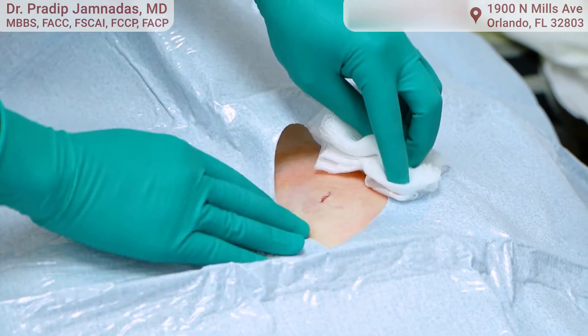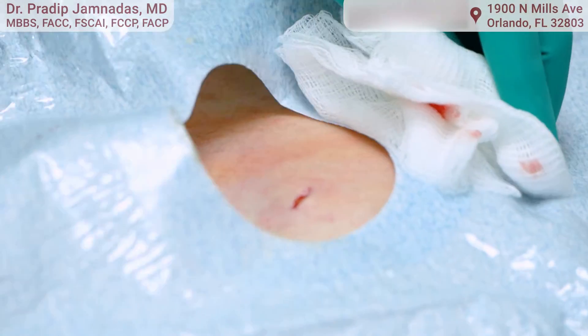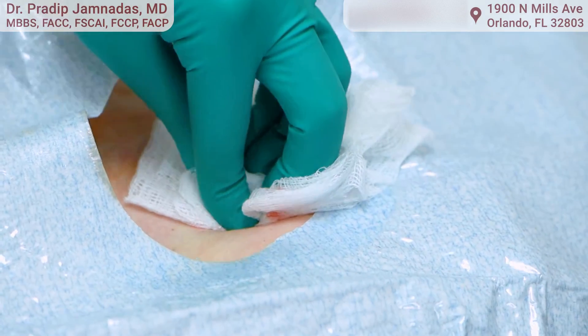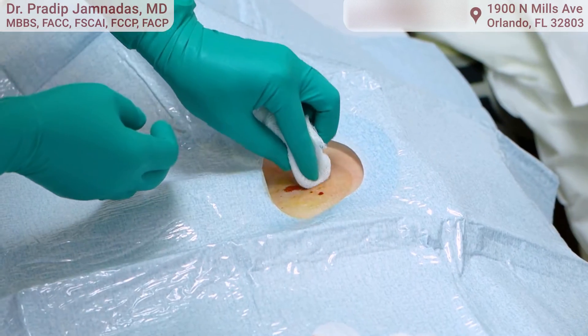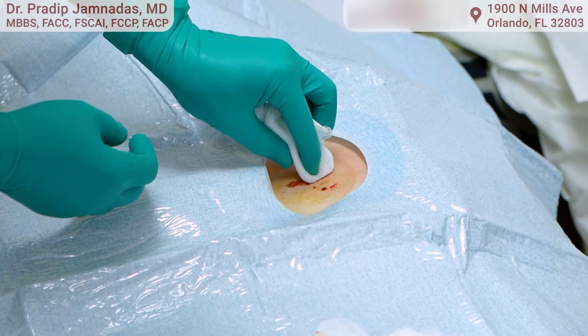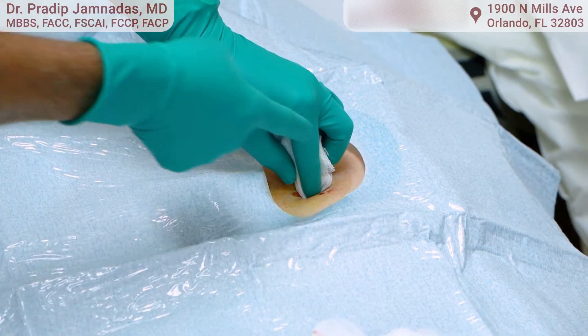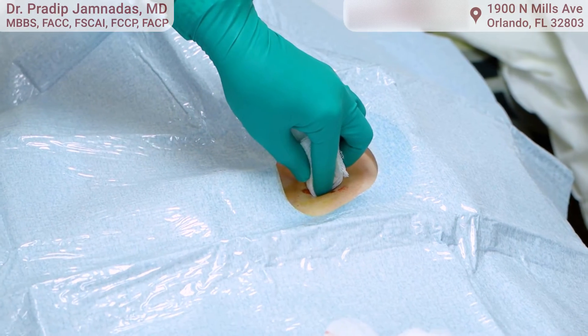There's the small little incision — that's it, that tiny little entry point. Now I'm going to put some sterile strips on it. Sometimes you can get a little bit of superficial bleeding; I'll just hold that for about a minute and then put the tape on it.